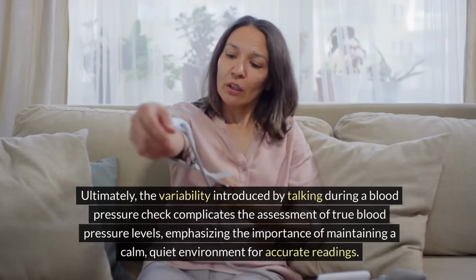6. Cuff too tight. When the cuff is too tight during a blood pressure measurement, it can give a falsely high reading. Imagine wearing a really tight bracelet that leaves marks on your skin. It's uncomfortable and affects the blood flow. Similarly, an overly tight cuff squeezes the arm too much, making it harder for blood to flow through the arteries. This can result in an artificially high blood pressure reading.